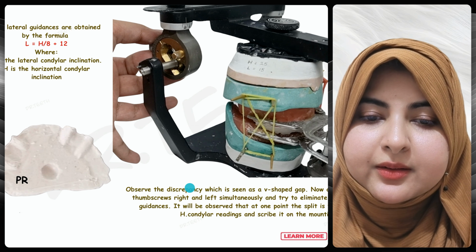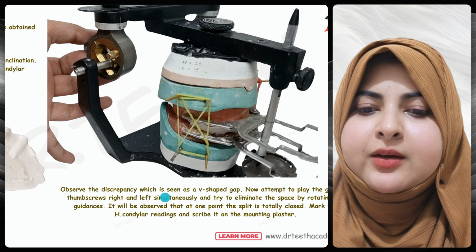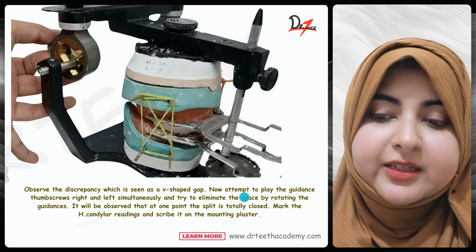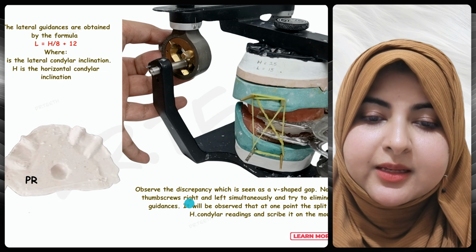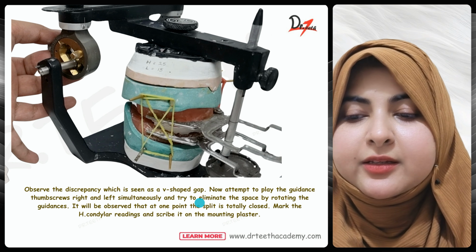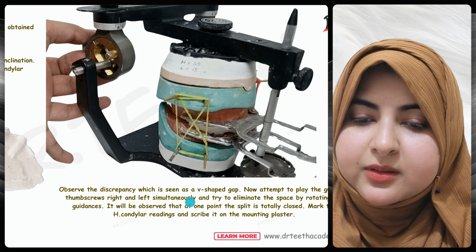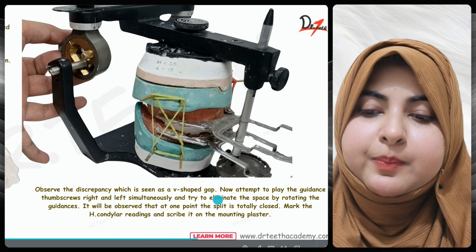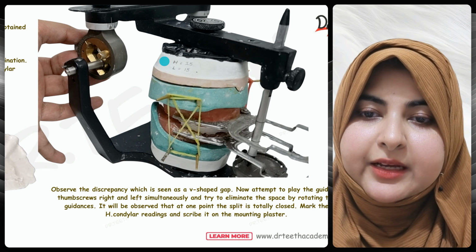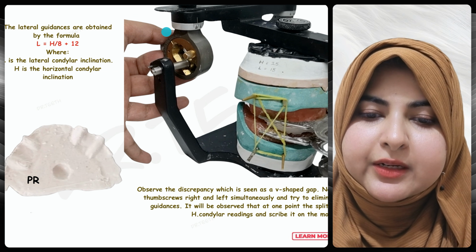You will observe a discrepancy after you place the protrusive record, which is seen as a V-shaped gap. Now you will attempt to turn the guidance thumb screw right and left simultaneously and try to eliminate this space by rotating the guidances. And it will be observed that at one point the split is totally closed, and then you will mark the H. As you can see, it has been marked 25 because we got a 25 reading here.